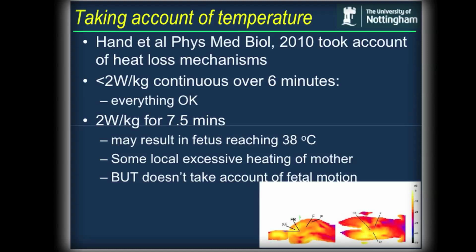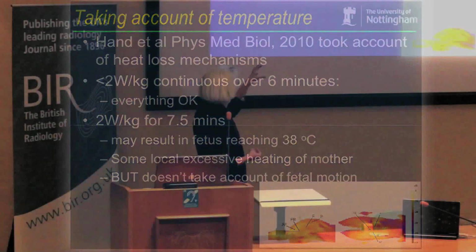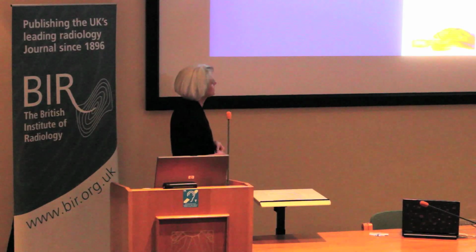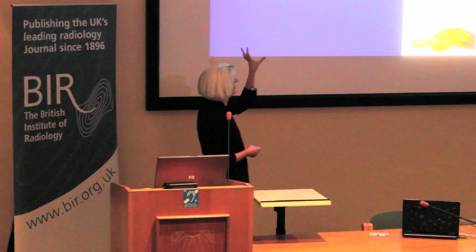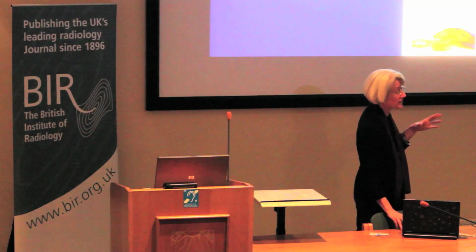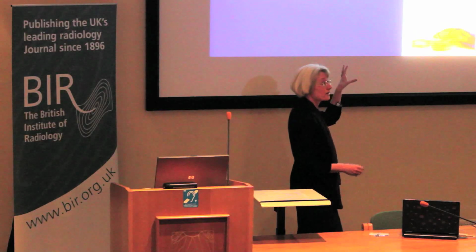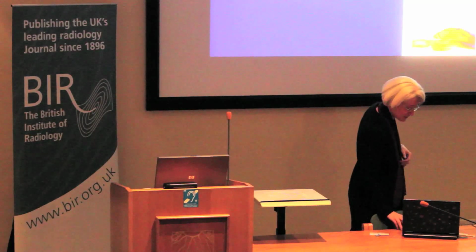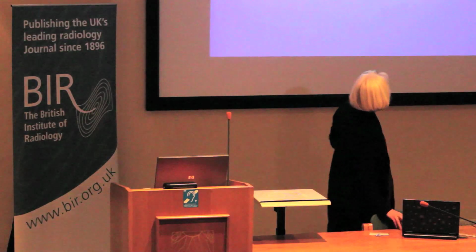Now I have to say, this is all based on physical modelling. None of this is done through measurements, this is all done on maths. And so there's room for error here, room for error both ways. For a start, it doesn't take account of fetal motion, which of course will stir things up and increase heat loss. So this is probably a conservative point of view, but it certainly means we're on the edge. And other sort of back-of-the-envelope calculations also suggest that we're on the edge, but we have to be careful here. We don't want to be exposing people above 2 watts.